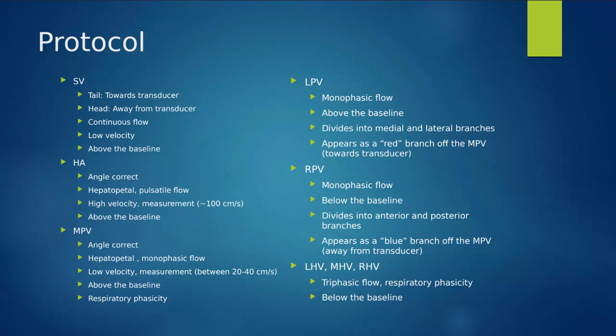Remember we talked about that, how that closes shortly after birth, or it can recanalize in presence of pathology. This is going to be very important when we have a patient with portal hypertension and cirrhosis. So our left portal vein, we're not going to be evaluating it all the way to the tip of that left lobe of the liver because it pretty much just branches off and divides by this region here. And again, nice continuous waveform above the baseline because it's heading towards our transducer.